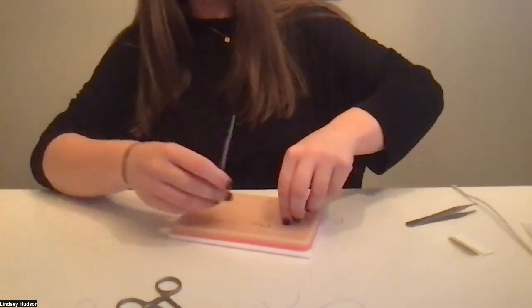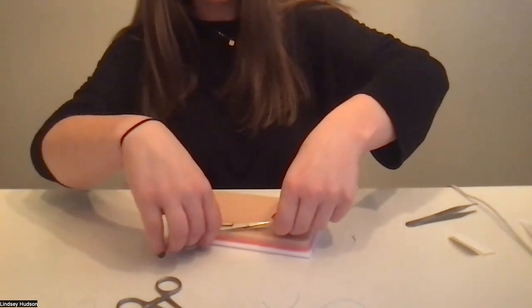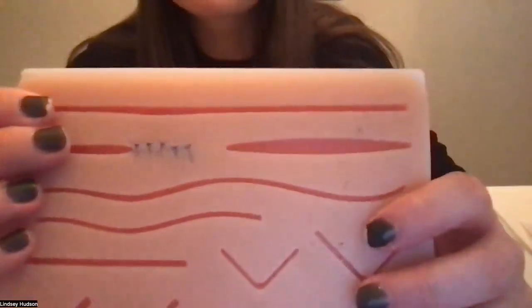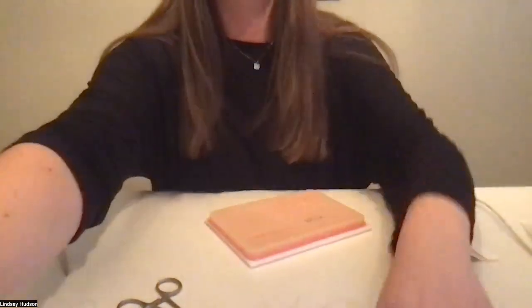So those are my 5 stitches. We have a good approximation of the wound. It's closed throughout. There's the sutures. All right, so now you would want to discuss with your patient aftercare with the sutures.